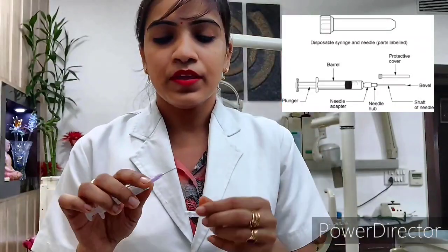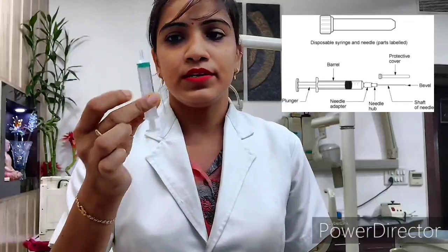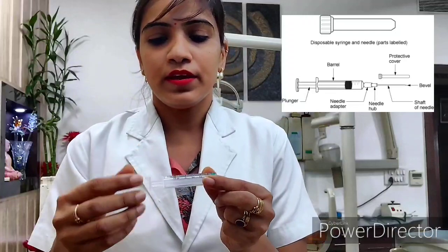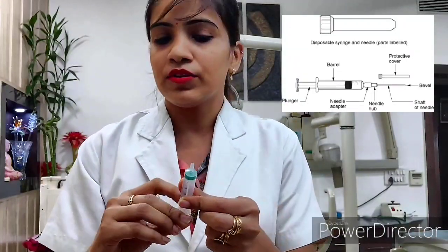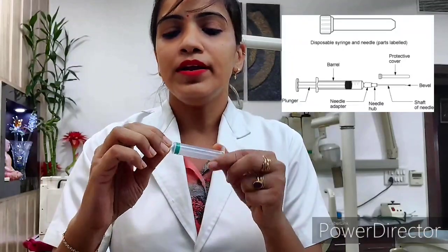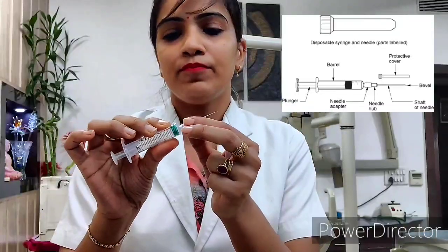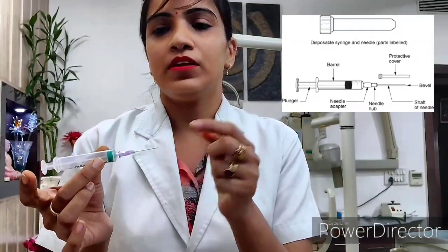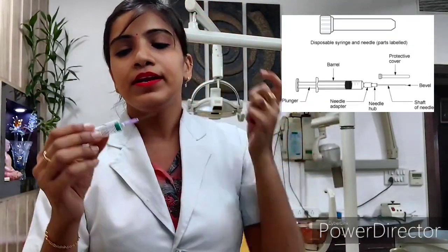This part is called a protective cover. This is a needle, and this is the syringe. This part is called the barrel. And this is the plunger, with which we fill the syringe or discard it. This is your needle adapter, and this is your needle hub. This is the shaft of the needle. And this is the bevel. So these are our needle and syringe parts.